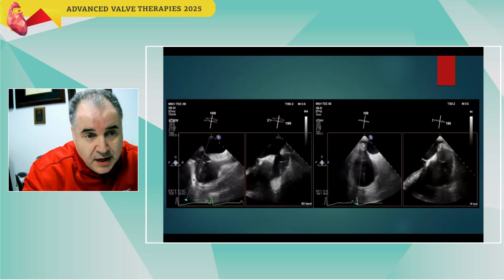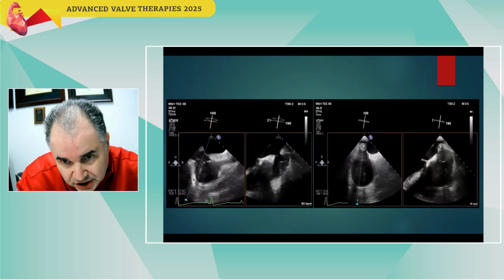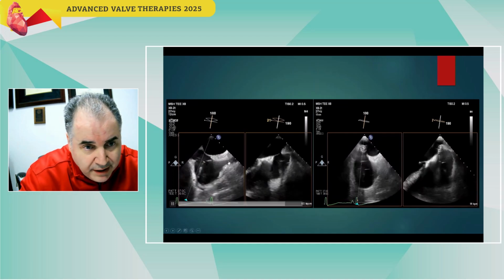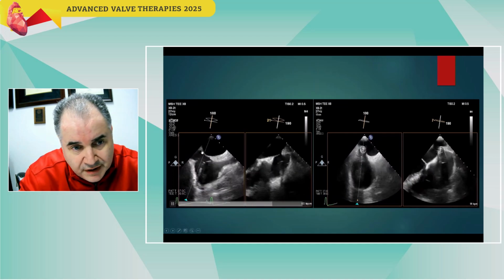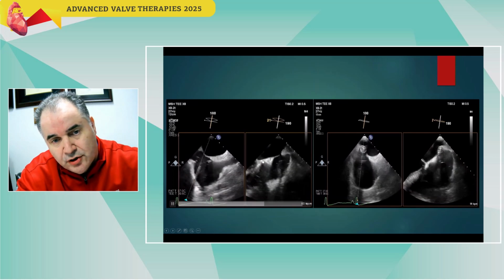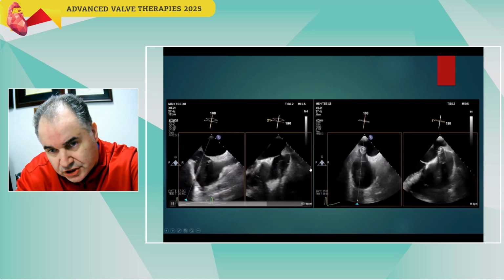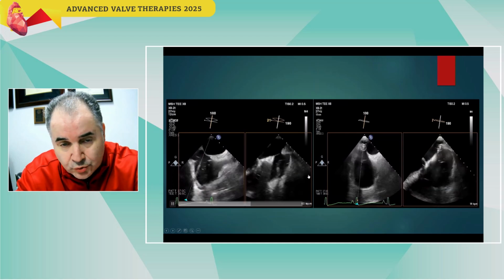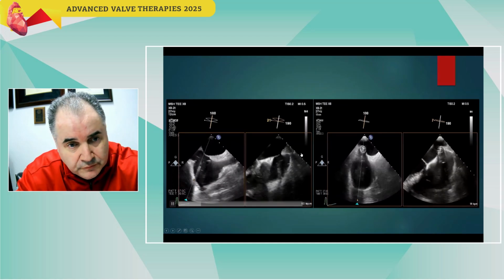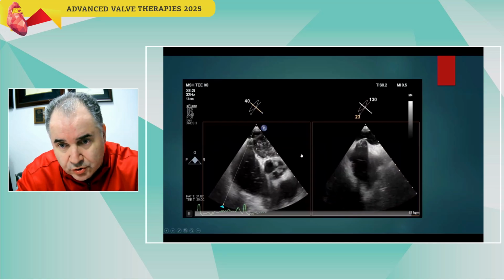And this is again the same transseptal approach. You have to go to the left side, as I told you, by the bicaval view: superior vena cava, superior part of the septum, inferior part, anterior with the aortic valve, posterior, and this is a safe cross catheter that we use sometimes to cross over to the left. Now they have crossed already to the left.